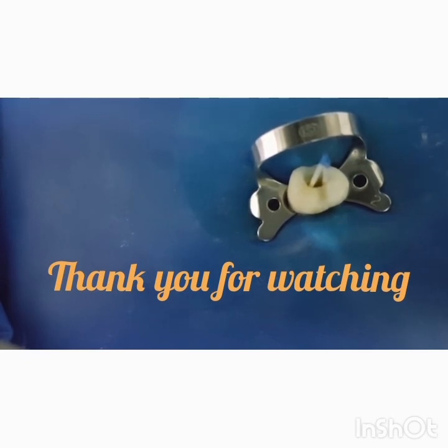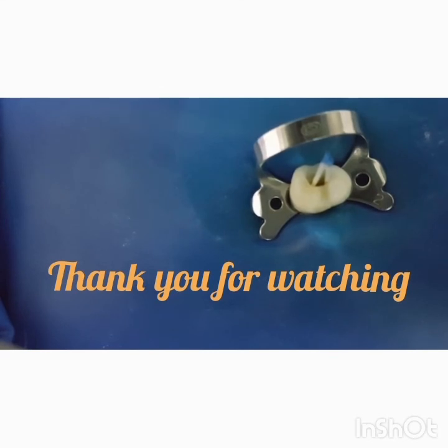This will ensure sufficient drying of the canals and good flow of the sealer, and also ensure that the gutta-percha reaches full length.